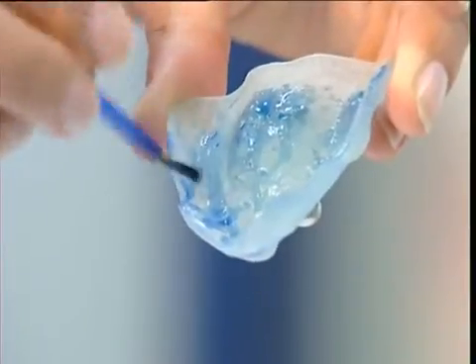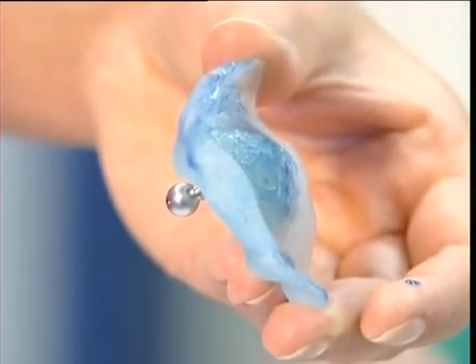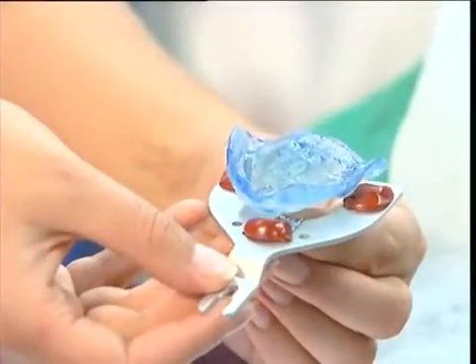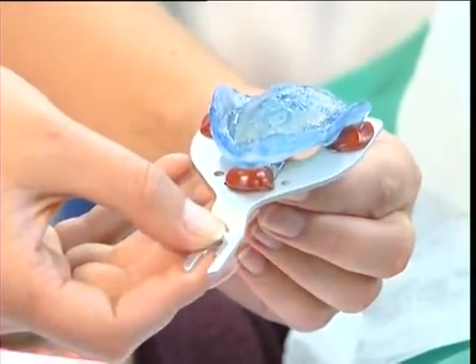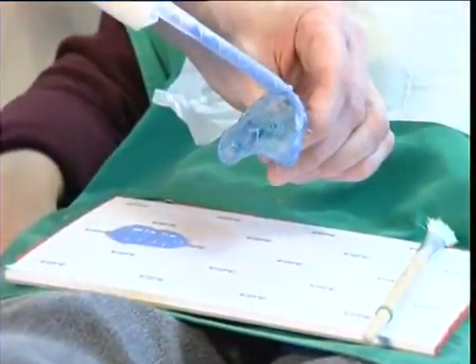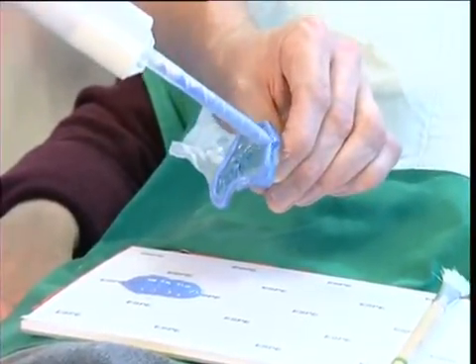Coat the entire surface of the functional impression trays with silicone adhesive. Whilst the adhesive is drying, the bite fork must be prepared for the facebow transfer. The upper functional tray is placed in the soft composition to create 3 clear indentations. The periphery of the special tray is coated with regular set silicone from the mixing tip for taking the final functional impression.